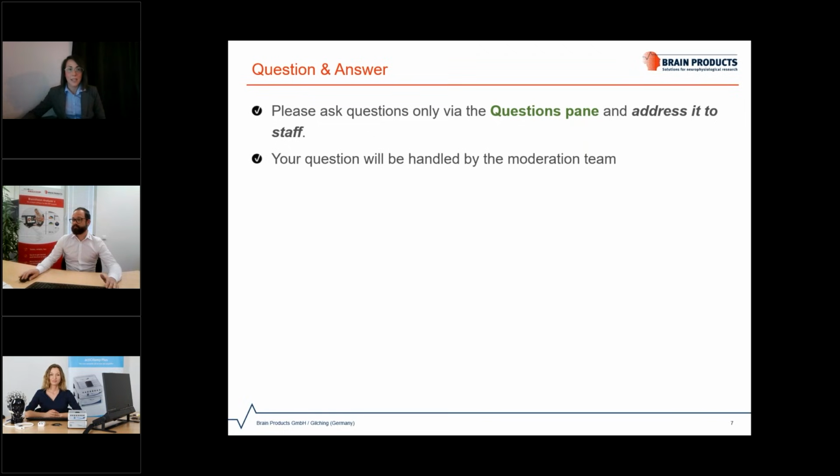A few more to ask. One would be for Laura, the first one. Can you please speak to the recording time, the average recording time for the RNet? The average recording time for this electrode system.